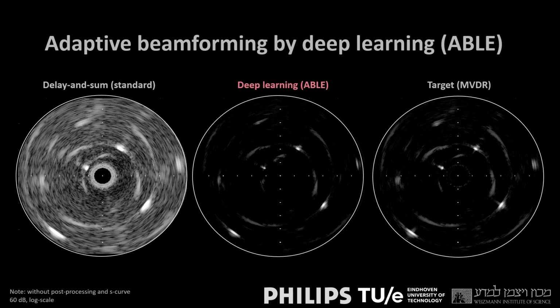And what we see in particular is that the denoising property of the deep network that we chose, an encoder-decoder structure, allows you to predict these apodizations in a very compact latent space, and hence all high entropy noise will not pass. This denoising property stabilizes the whole weight prediction process and makes it actually more stable than the MVDR.